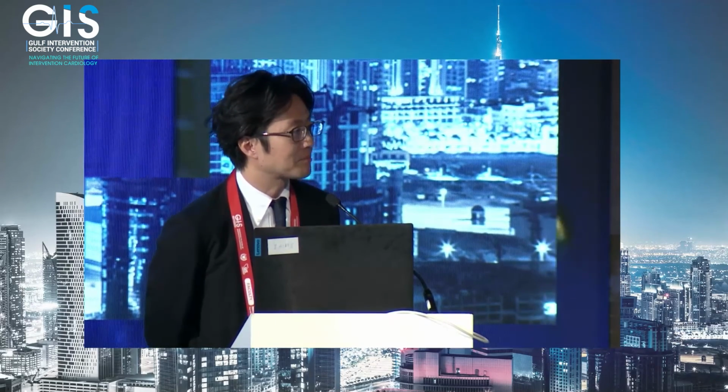Thanks, it's a great presentation. It shows how bifurcation stenting needs to be well thought out and well planned. My question: in the Japanese registry, what percentage of operators failed to recross? And in failure of recrossing, how did OCT help, or fail to help?